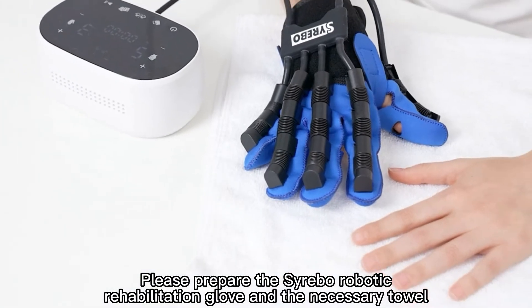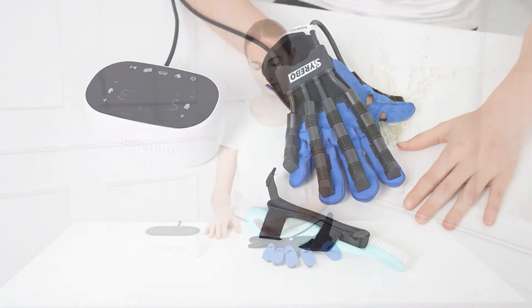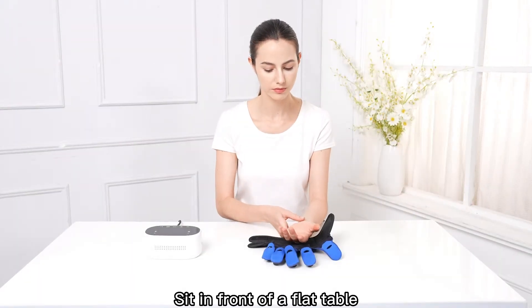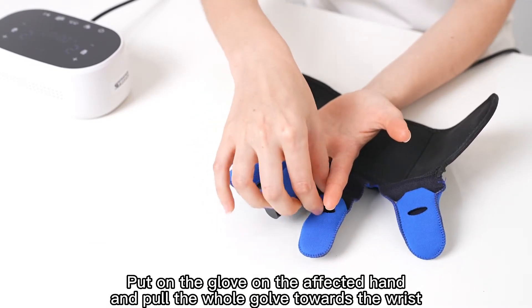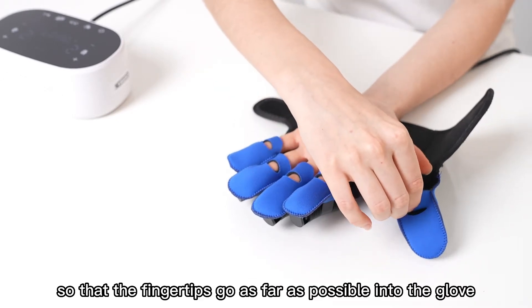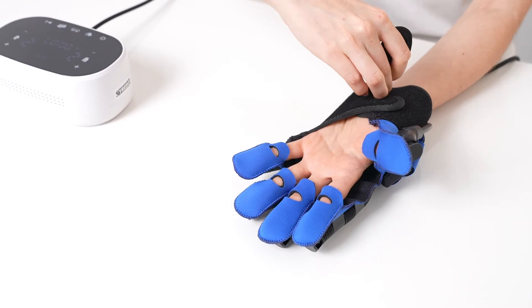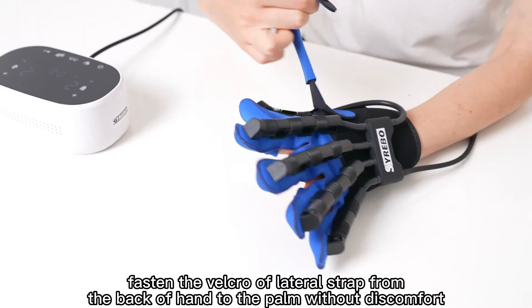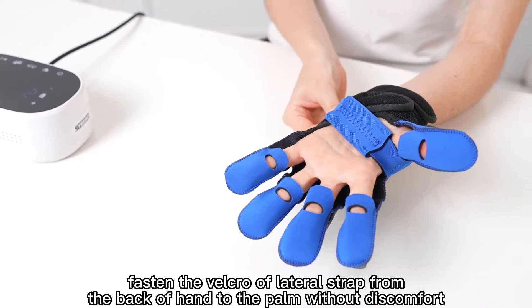Please prepare the Syrebo Robotic Rehabilitation Glove and the necessary towel. Sit in front of a flat table. Put on the glove on the affected hand and pull the whole glove towards the wrist so that the fingertips go as far as possible into the glove. Then tighten on the wrist. Fasten the Velcro of the lateral strap from the back of the hand to the palm without discomfort.